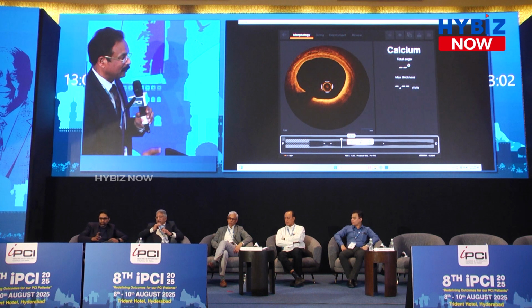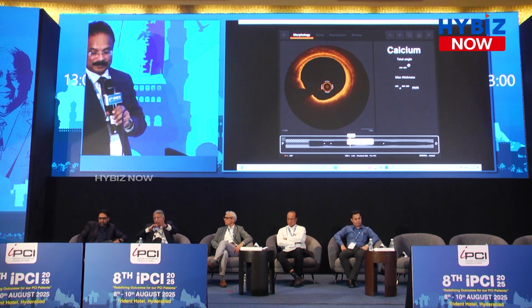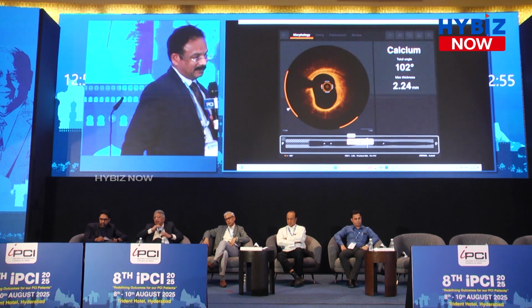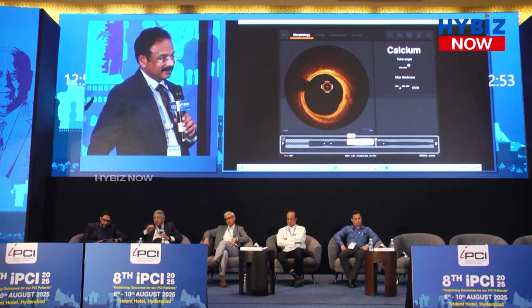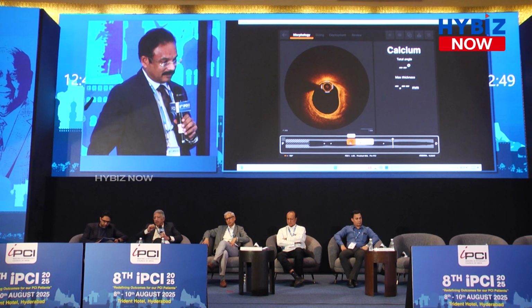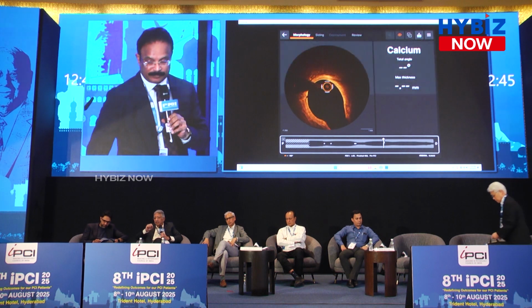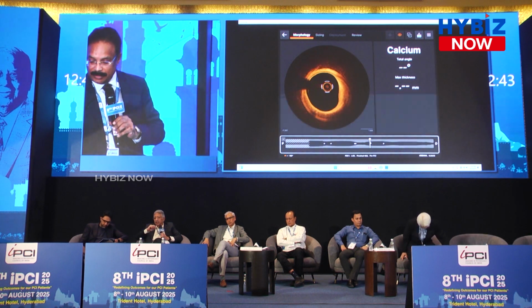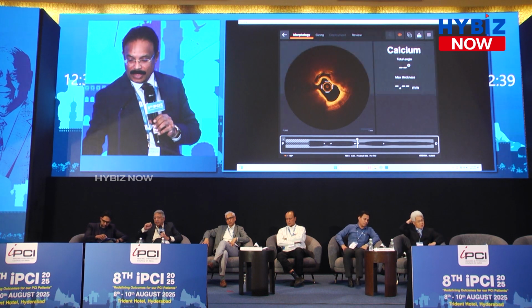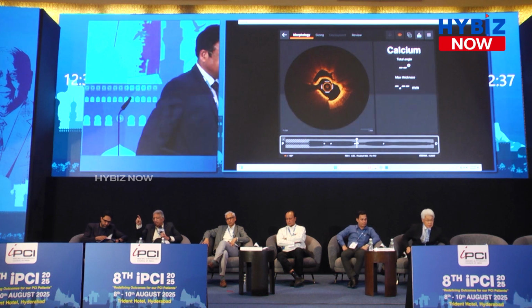Yeah, obviously. This is the morphology that you're seeing, and you see the good EEL there. Now, I think you should stop over there if it's possible, because it's too fast for everybody to see that. Get to the area of interest. Go back. Wait, stop there. And now you click the co-registration on top.